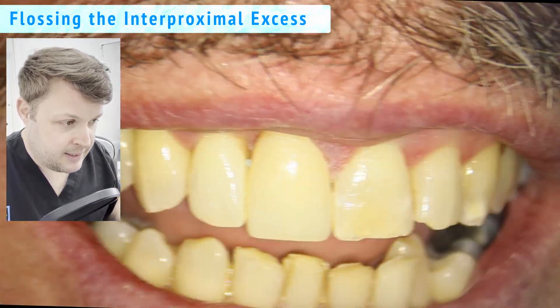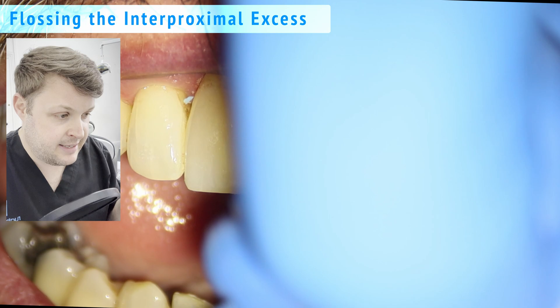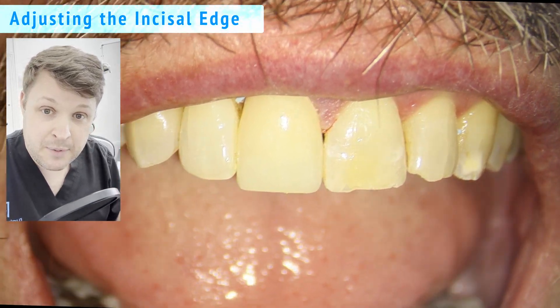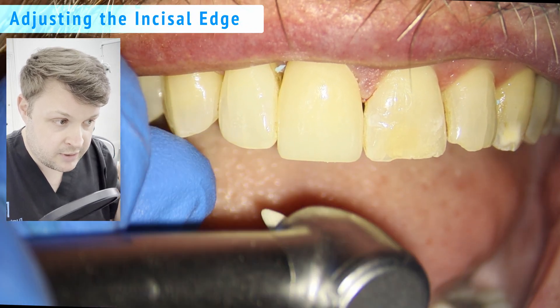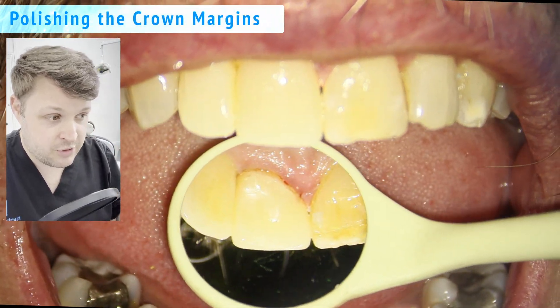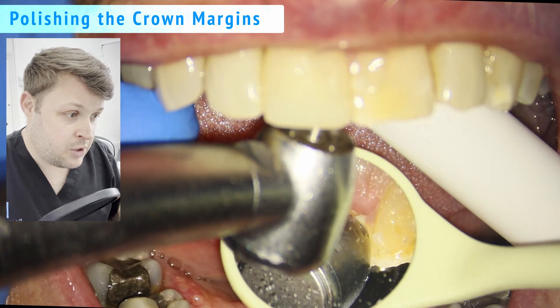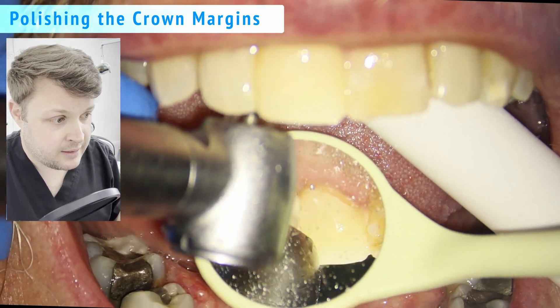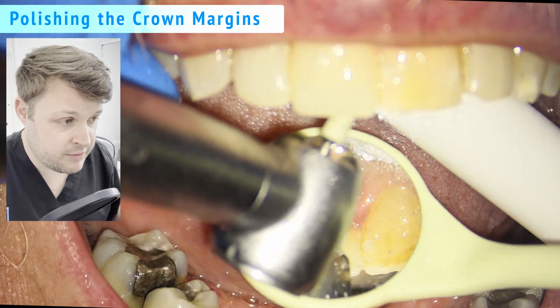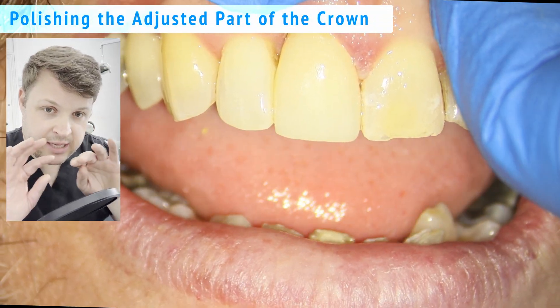We're pulling away the rubber dam and flossing. At this point I give the patient a mirror to have a look — he says he's happy with the color and the fit. However, the distal corner on this crown makes the tooth look too long and unnatural, so I've taken it down a little with a diamond bur, then used a white stone to adjust the margins, being careful not to nick the gingiva. I just want to remove the excess, not the margin itself.